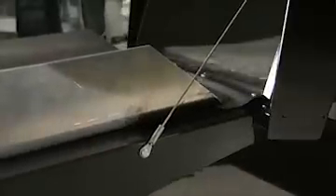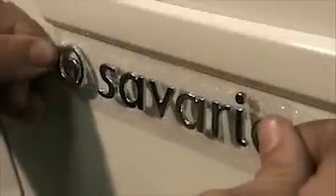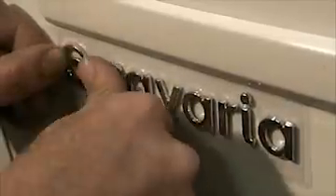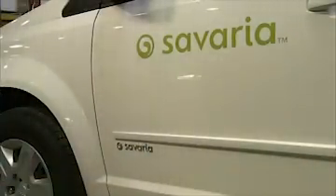Hidden springs at the end of the cables provide tension to significantly lighten the load for the operator. The ramp weighs 60 kilograms, but the operator ends up lifting just 7 kilograms of that due to the spring-loaded tension. They reinstall the interior plastic panels and repurpose the original second-row seat belts. As they finish up inside, an employee puts the company name on the door of the vehicle.